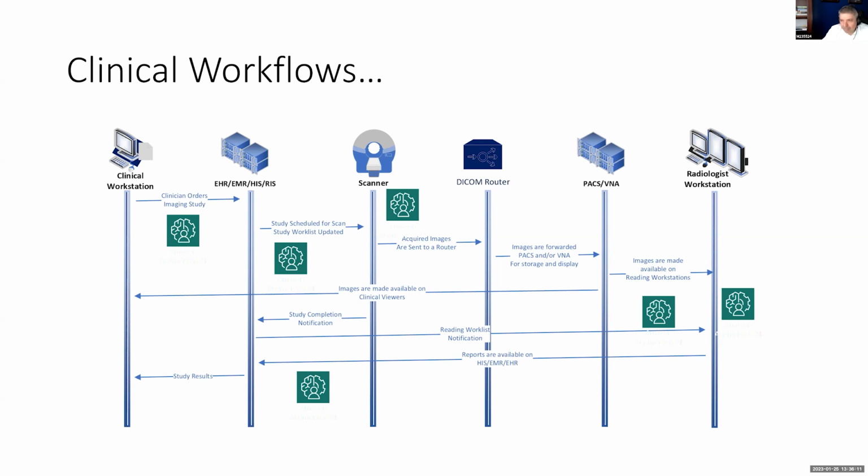So what I described here, I tried to make it as short as possible, was a somewhat traditional imaging workflow. And within this workflow, there are certain places you can utilize AI to aid different components of this workflow. So in traditional systems today, in most hospitals in the US, there is what we call a clinical decision support system in the ordering phase.